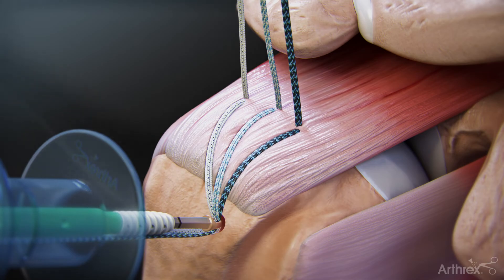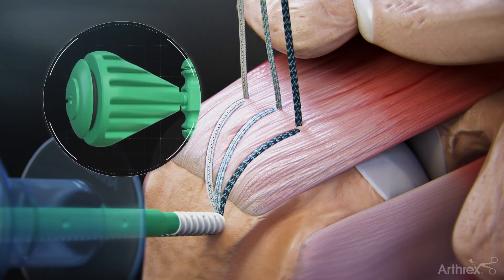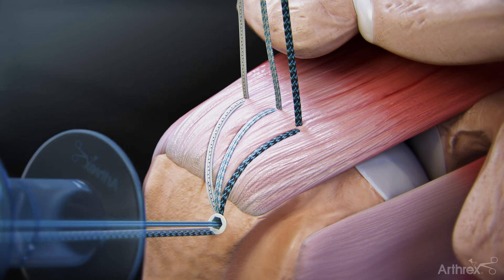With the eyelet above the bone socket, remove slack from each FibreTape individually. With all slack removed, advance the eyelet of the swivel lock into the bone socket. Hold the thumb pad and rotate the driver handle to advance the swivel lock suture anchor until it is flush with the bone. Remove the fiber wire tip retention suture from the swivel lock anchor, then cut the FibreTape suture tails.